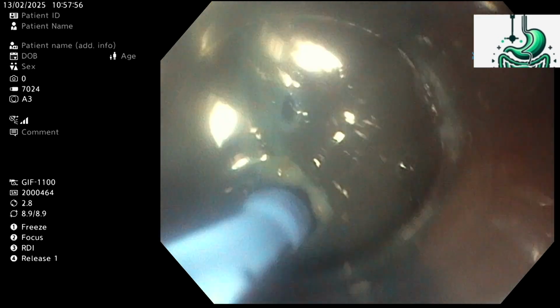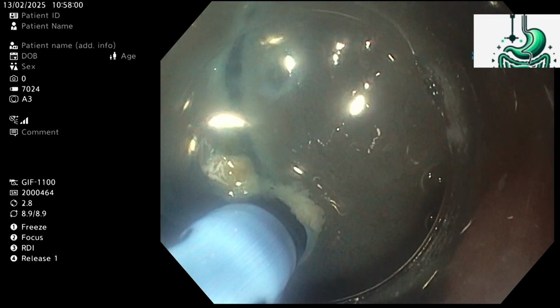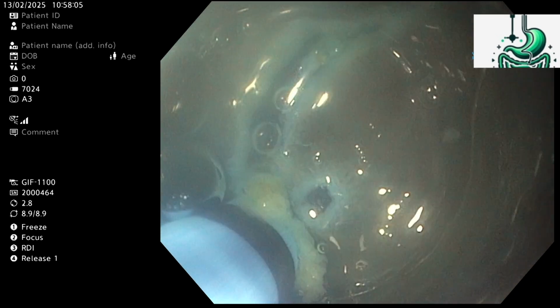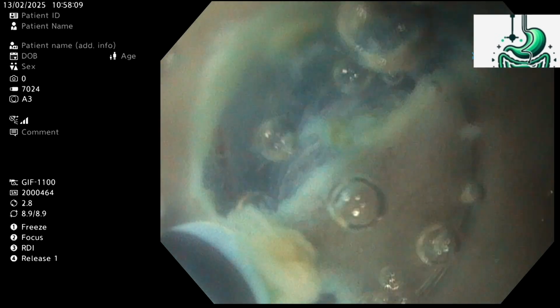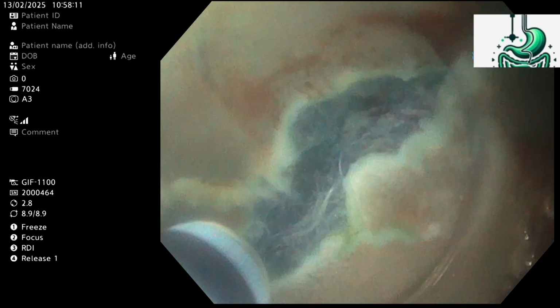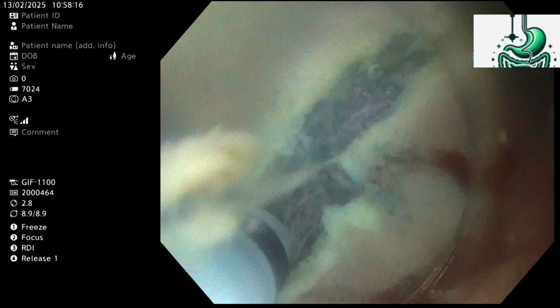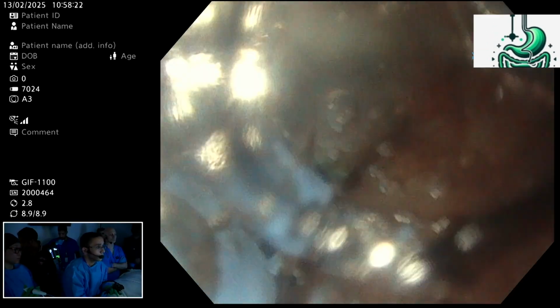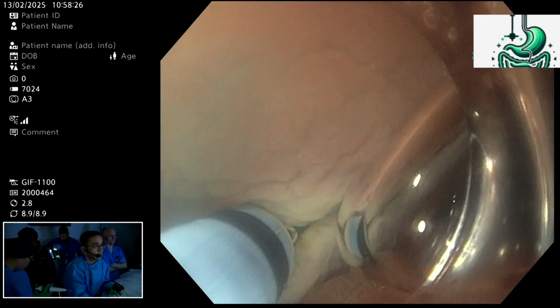We have a question. Yes, please. Thank you. Hi, Alberto. Hey, hi, Ahmed. It's Edward Despot from the audience. Why have you chosen to start with an incision on the oral side? Wouldn't it have been a more stable strategy to approach this lesion using the pocket creation method rather than an incision on the oral side?